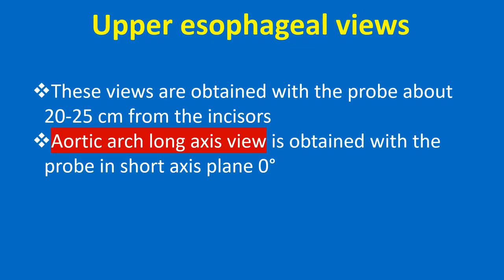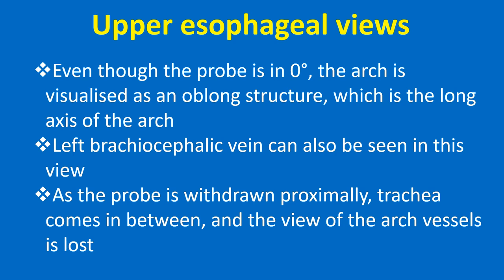Upper esophageal views are obtained with the probe about 20-25 cm from the incisors. The aortic arch long axis view is obtained with the probe in the short axis plane at 0 degrees. Even though the probe is at 0 degrees, the arch is visualized as an oblong structure, which is the long axis of the arch. The left brachiocephalic vein can also be seen in this view. As the probe is withdrawn proximally, the trachea comes in between and the view of the arch vessels is lost.